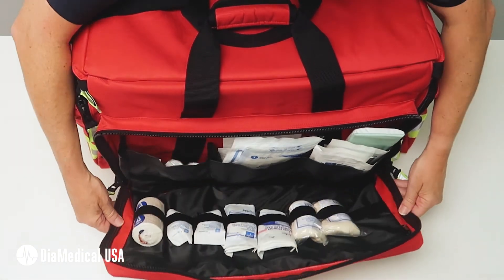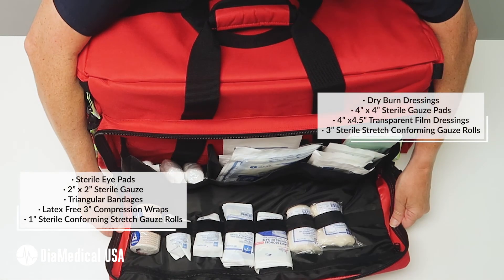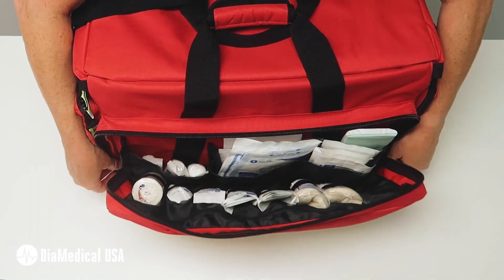The back pocket contains sterile bandages for burns and bleeding wounds. Elastic retainer bands are used here as well so you can quickly grab what you need. The latex-free elastic bandages have self-closure so you don't have to worry about clips.